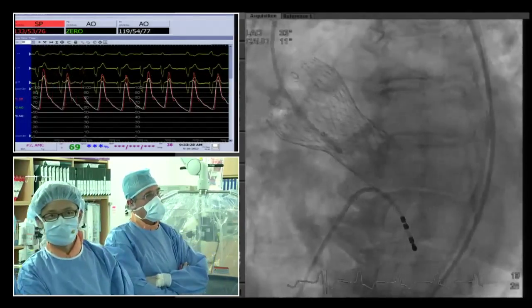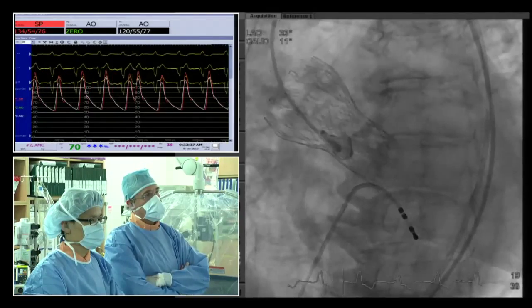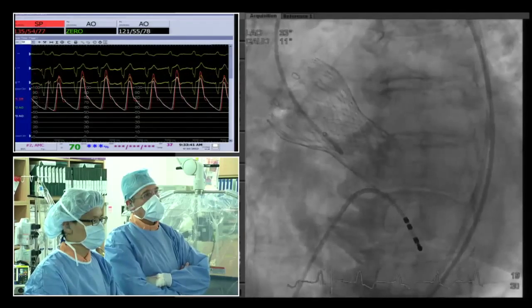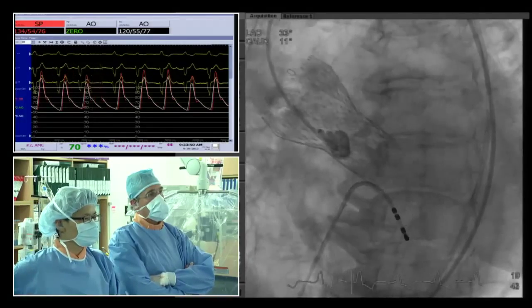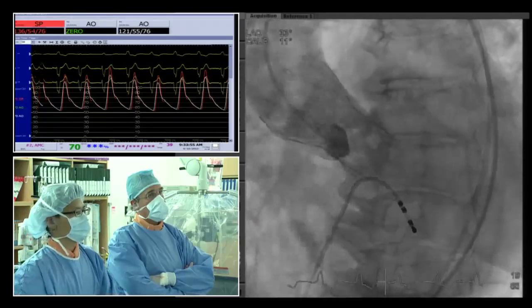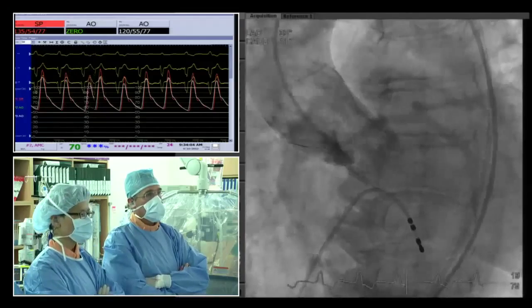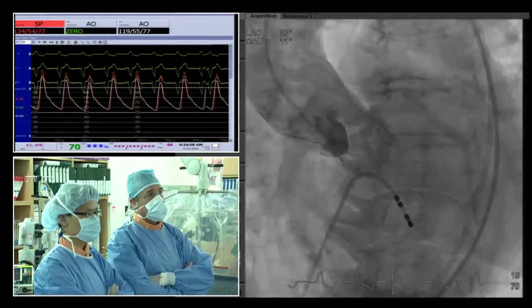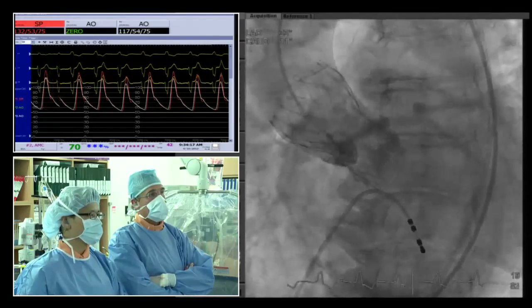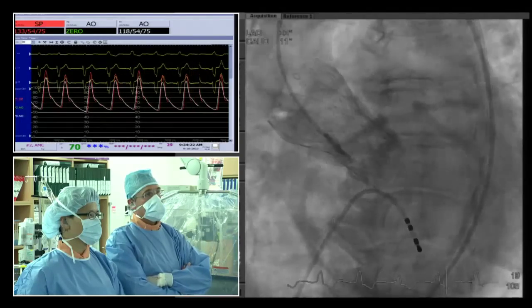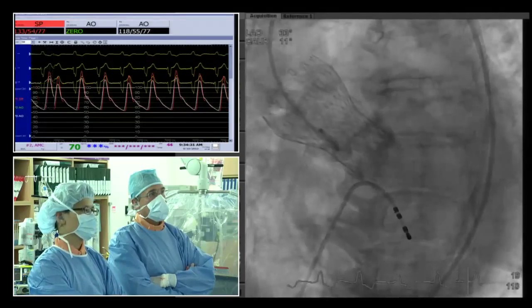The panelist continues: hemodynamic assessment after TAVR is important — measuring LV end-diastolic pressure at the end of the procedure confirms a good result. Angiography is also performed routinely, sometimes in multiple projections especially for bicuspid valves, where a second view may show the valve is not adequately dilated. After such a high-risk procedure, confirming a good result at the end is essential.